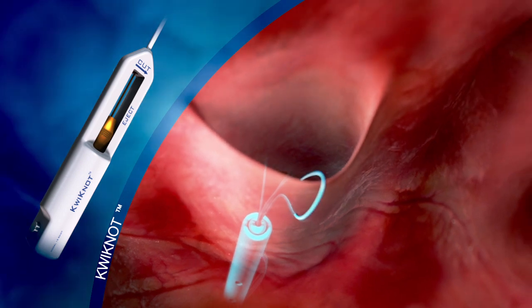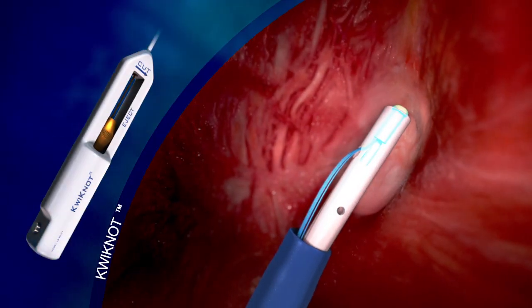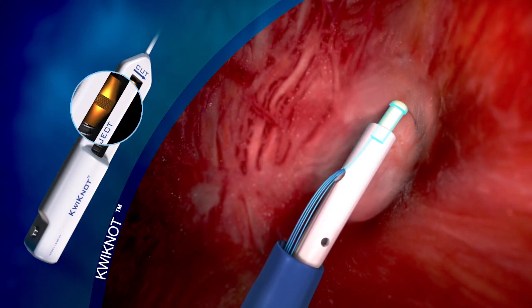By applying tension to the sutures and advancing the quick knot, the septum primum is folded inside the tunnel, creating a reverse type valve that completely closes the PFO tunnel. The polypropylene knot is then deployed by pushing the activation button.